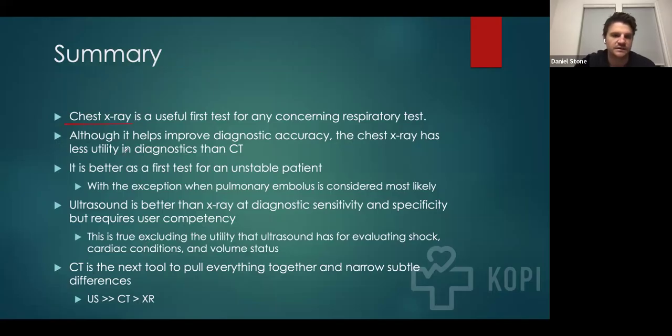Chest X-ray is a useful test. It's a very useful test in respiratory evaluation. It can improve diagnostic accuracy, though it's been surmounted by CT as something that can improve patient care. It is the best first test for a patient who's unstable, and a portable chest is certainly something that I would always remember to reach for if you can. It improves diagnostic sensitivity and specificity.